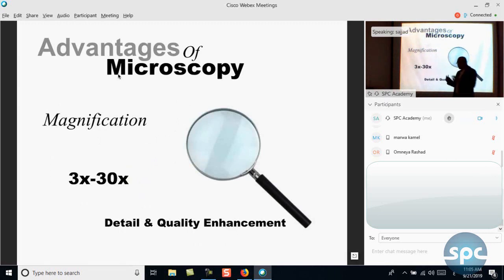Okay, but with a microscope you have the ability to go up on your magnification or go down depending on your need. So if I'm looking for an instrument fracture at the apex, I can go up to 18x. If I'm doing a crown preparation, I can go back to 6x as I like. Big difference.